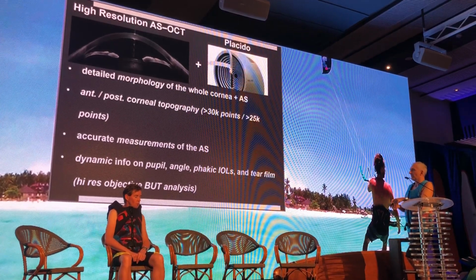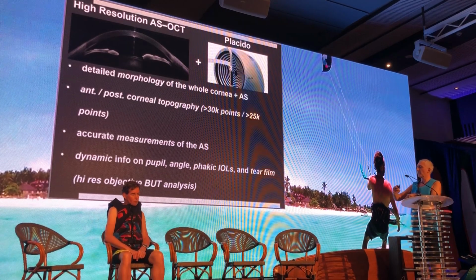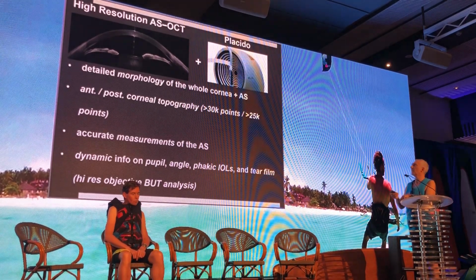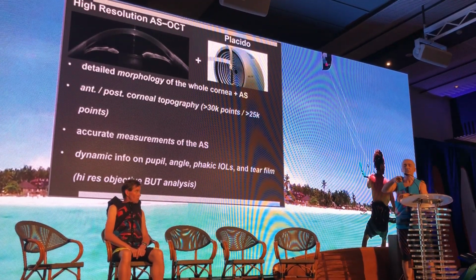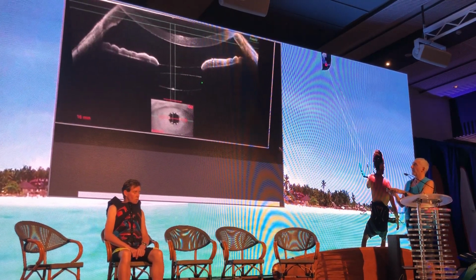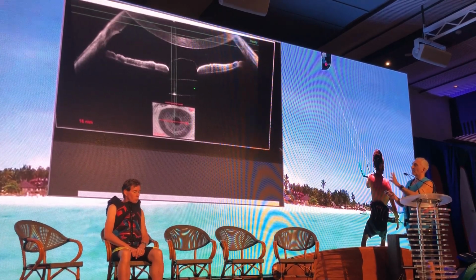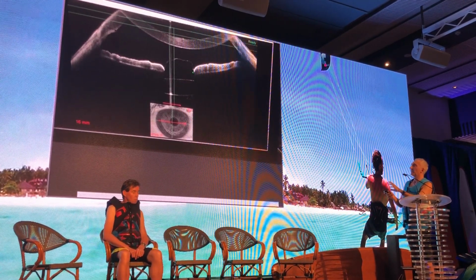I want to show just very quickly, because where should I point this to change? Yeah. This was funny. This was actually taken with my phone. The video was not, it was 2 years ago, was not yet there.